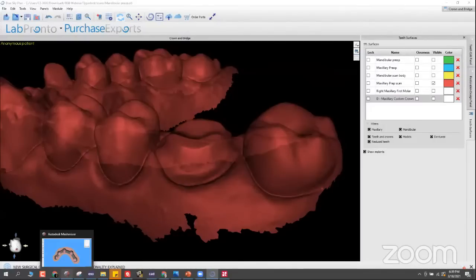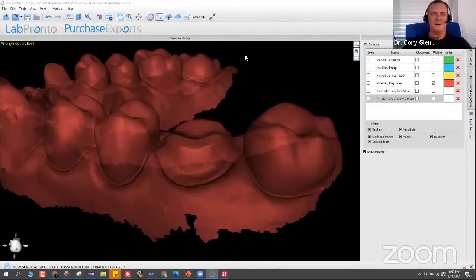So I'd say spend a bit more, get more specs. It will save you processing time. It'll make the software work much better. Today, STL files are quite heavy. They keep getting heavier and heavier from the intraoral scanners, from desktop scanners. Same thing with CT scans. So if possible, I'd say spend a bit more, get 32 gigabytes of RAM, get an i7 processor or better, and get the dedicated RAM on the video card. That's an important point. All right. Good job. That was better than my answer would have been.